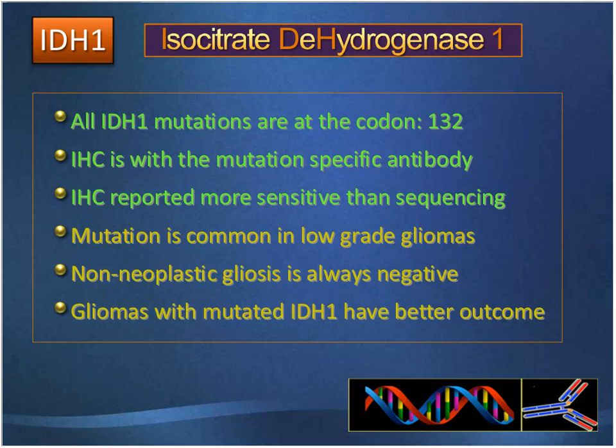In fact, some of the higher grade gliomas can also be positive for IDH1, and those are the ones which can have a better outcome. And that's one reason that IDH1 now is routinely performed on all the gliomas regardless of degree of differentiation.